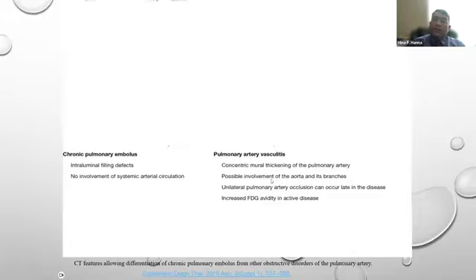Vasculitis is another thing because with vasculitis, the vessels start to close and there is collateral circulation. But again, in those patients, you will find the involvement of other arteries other than the pulmonary artery. You will find the mural thickening and you will find that most of the disease is in the wall, not inside the lumen. And if you do a PET-CT, you will find enhancement or FDG uptake in the wall rather than in the lumen.